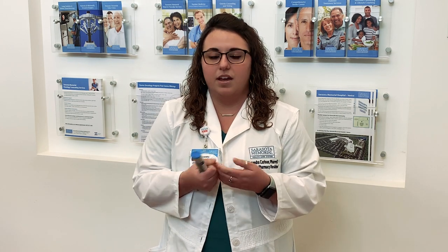So it's important, before you have an allergic reaction where you need to use this EpiPen, that you actually look at your directions. I urge you to go find your EpiPen or your epinephrine pen and read your directions right now so you know how to use it, because it's not the time to try to figure out how to use it when you have an allergic reaction like that.